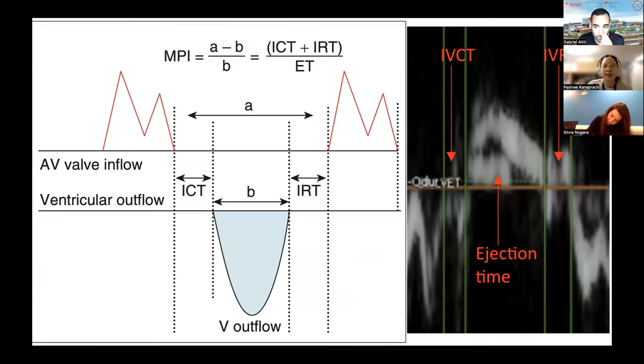Just only the reason, only for the resolution? Resolution, but also because you're increasing your error of sampling, because to do it with pulse wave, you actually need to get two Dopplers, versus here, you're doing it on the same Doppler. And as you know, there's always going to be beat to beat variation in loading conditions, in heart rate, in afterload. So the more you have to take clips to measure this one marker, the more you increase the risk of sampling mistakes. Does that make sense?